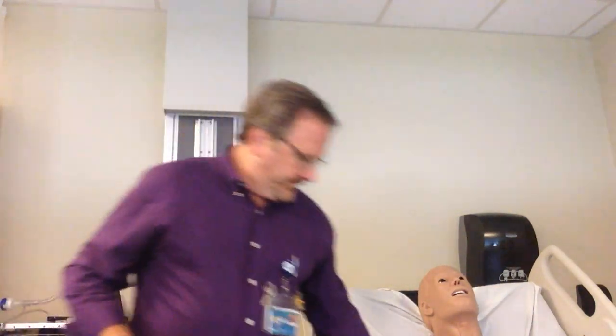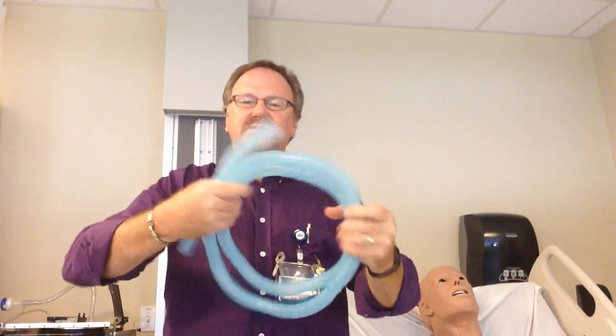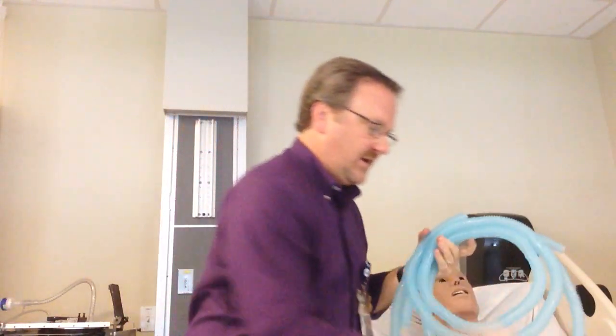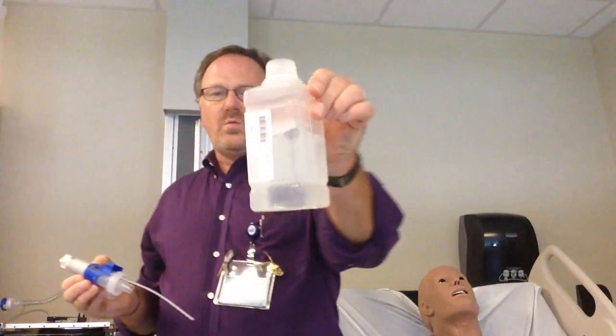You do not want a high liter flow, mainly because it would cool the baby. The other equipment you need is, of course, a flow meter. You also need two sections of large-bore corrugated tubing — about six feet long each. You will need a drainage bag because of condensation occurring; you want that to drain out. And you also need water.